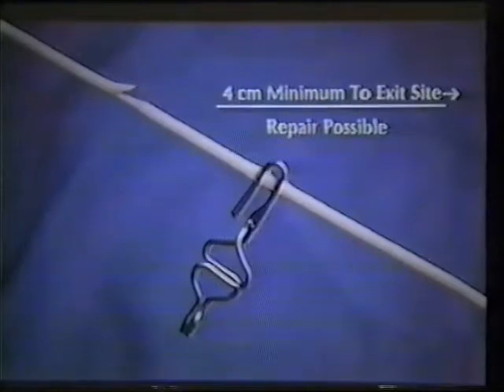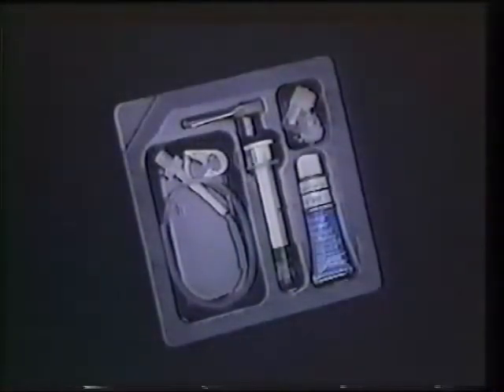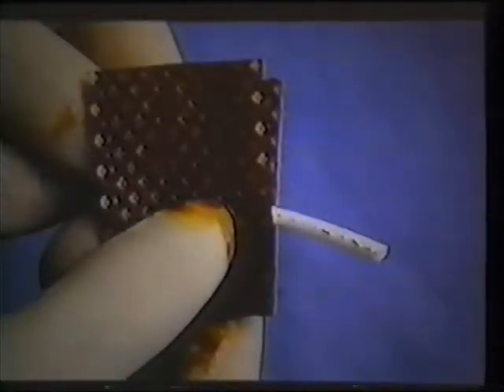A damaged Hickman catheter can be repaired if four centimeters or more of intact catheter extend from the chest wall. Permanent repair kits are available for all Hickman and Broviac catheters; because these catheters have different lumen sizes, it is important that the proper repair kit is used. To repair a catheter, first prepare a sterile field using a sterile towel or drape. Lay out the items from the repair kit, plus alcohol wipes, gauze sponges, and sterile scissors on the sterile field. Wear sterile gloves. Using a povidone iodine swab, cleanse for two minutes the portion of damaged catheter to be spliced, and allow it to air dry.